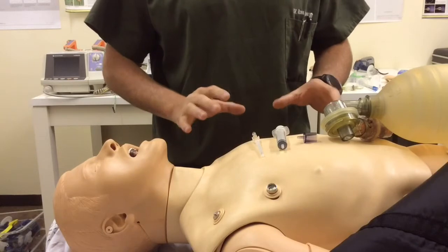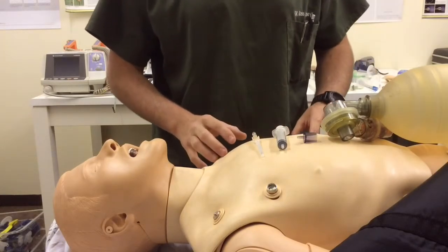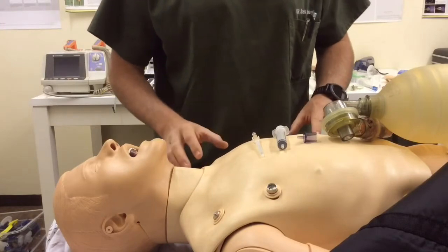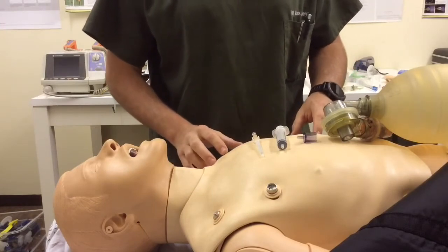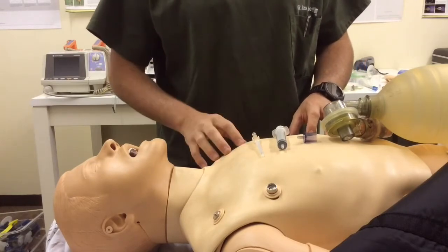I'm not going to go into the debate between needle and surgical cricothyroidotomy this time, because I think that's a good debate that needs to rage on, but I thought I'll add these nuggets from the coalface. I haven't got piped oxygen in my lab to do the actual oxygenation.